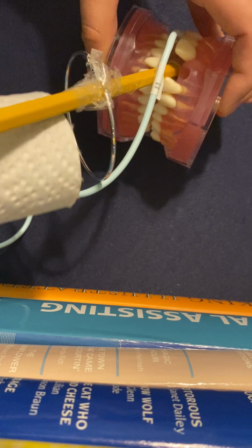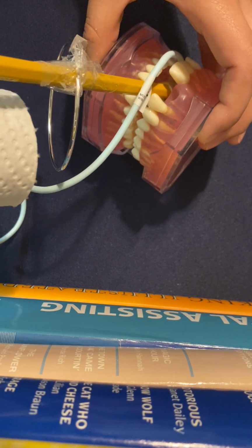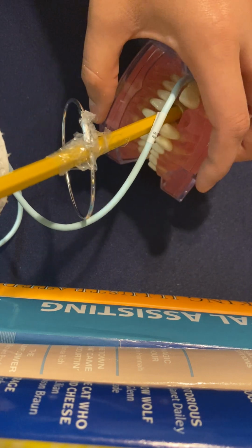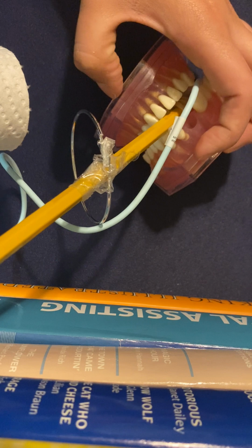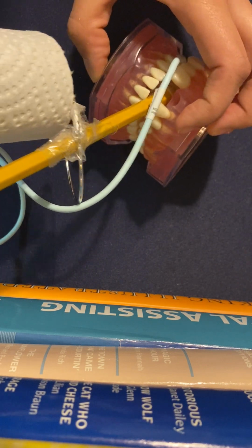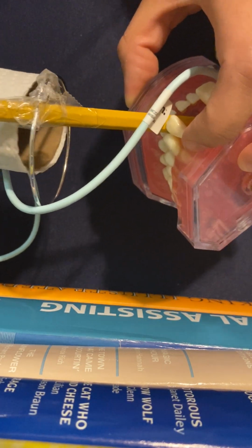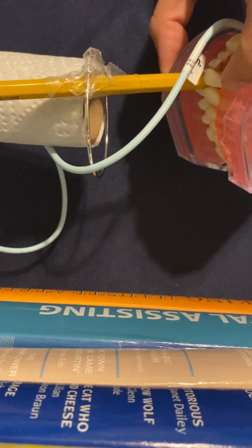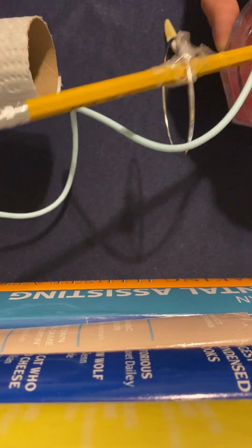And the central ray is going to point down from the ala to the chin corner. So where my thumb is, if you can't see that, his chin would be right around here. So you're going to want to do it from the chin. It's going to be more of an upward angle. Don't know if I can express that enough. It's going to be very upwards.